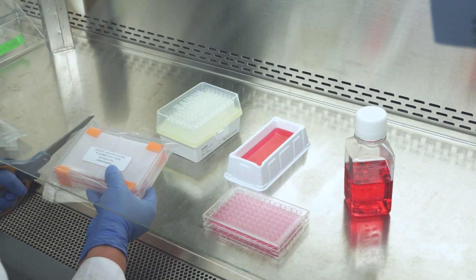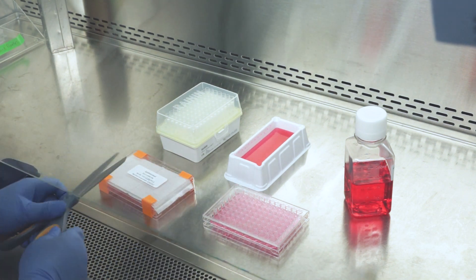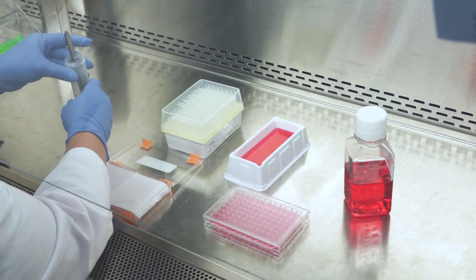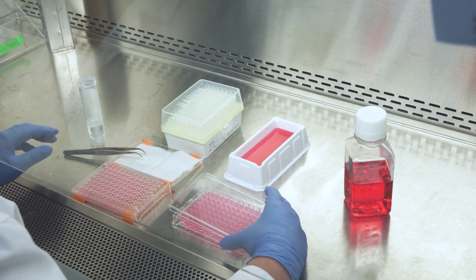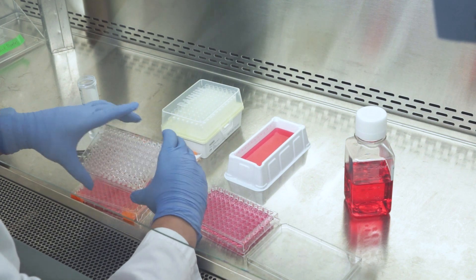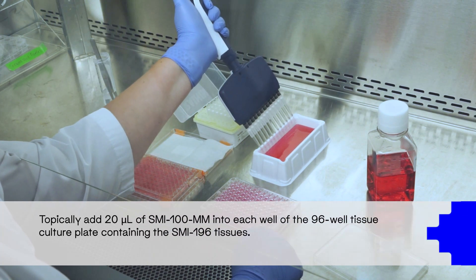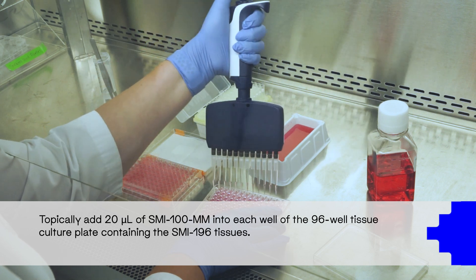Taking hold of the Epi-Intestinal 196 tissue plate, using either scissors or a scalpel, remove both layers of packaging and carefully slice the lab tape where the plate cover meets the base. Opening the plate gently, remove the cover and place it topside down. Using sterile technique, carefully lift the Epi-Intestinal 196 tissue culture plate and transfer it to the 96-well receiver tray with the pre-equilibrated media. With your preferred pipetting method, topically add 20 microliters of assay medium into each well of the 96-well tissue culture plate containing the Epi-Intestinal 196 tissues.